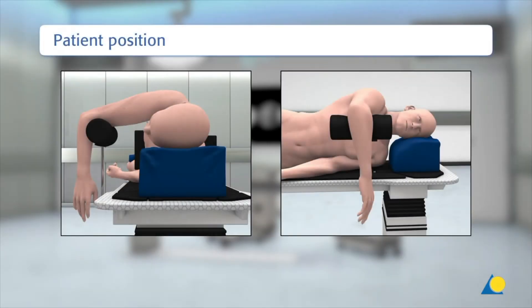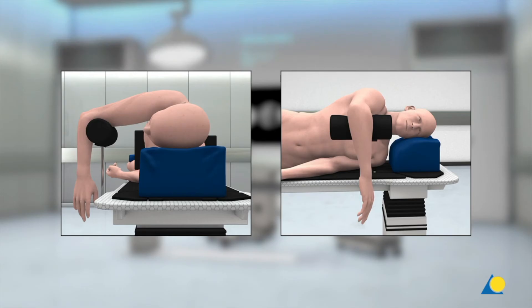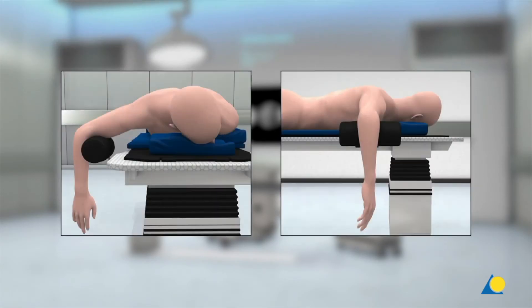To obtain sufficient exposure of the fracture, the patient is placed either in a lateral decubitus position or a prone position. The prone position is the preferred option. A short arm support is used so that the surgeon may sit. Care must be taken to ensure that the elbow can be flexed at least to an angle of between 110 and 120 degrees.